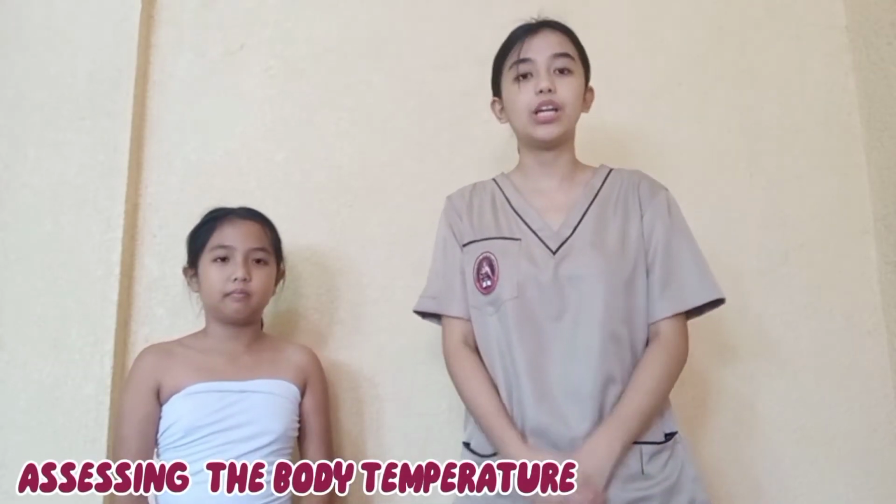So next, let's proceed to assessing the body temperature. The goal of this procedure is to establish baseline data for subsequent evaluation, to identify whether the core temperature is within normal range, to determine changes in the core temperature in response to specific therapies, and to monitor clients at risk for imbalanced body temperature.